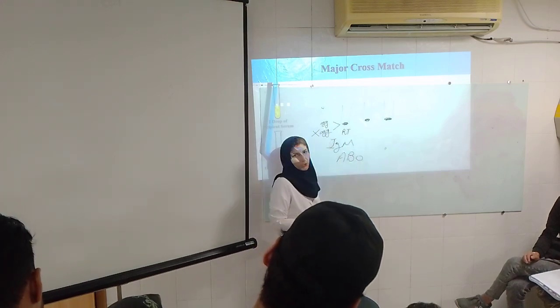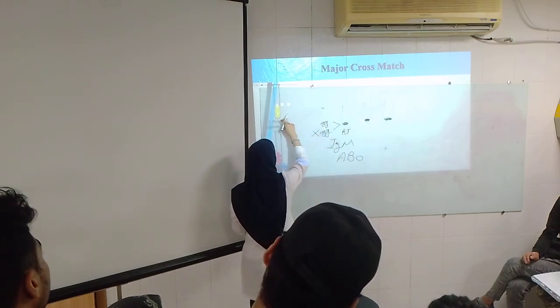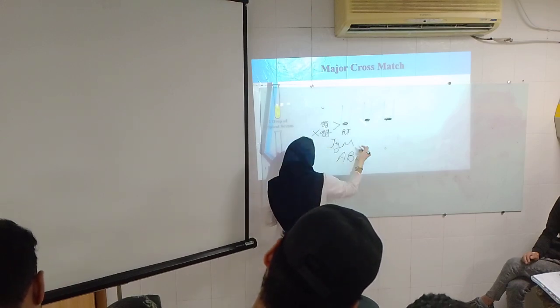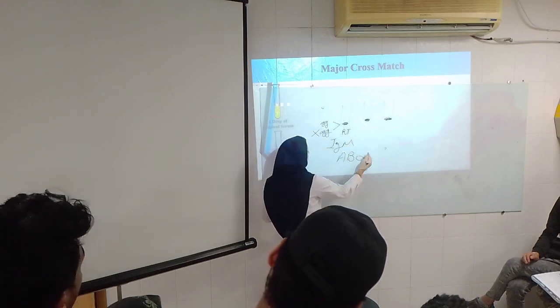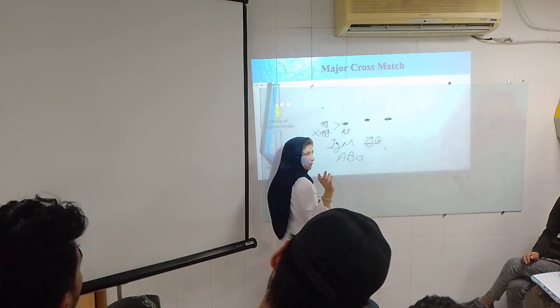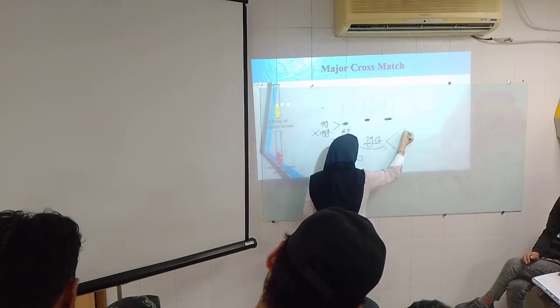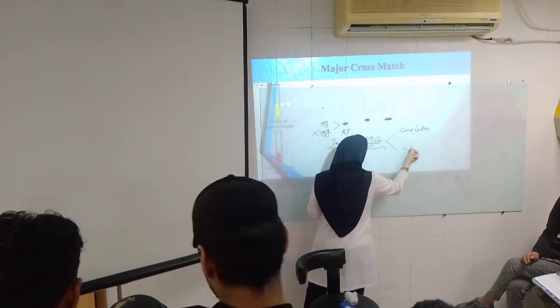How about other tubes? In the second tube, again, I mix the recipient and donor RBCs and serum with each other. But in these tubes, I want to detect one unexpected antibody, something like IgG, that relate to Rh factor mechanism. For detecting IgG, we have two kinds of IgG, complete IgG or incomplete IgG.